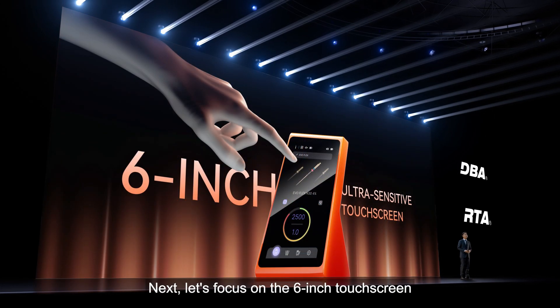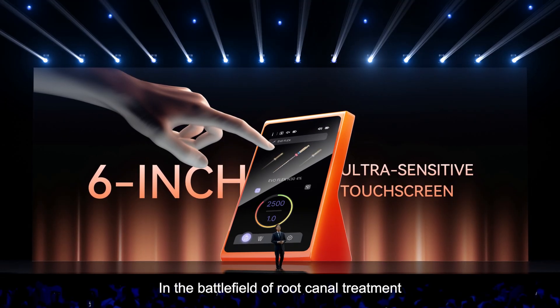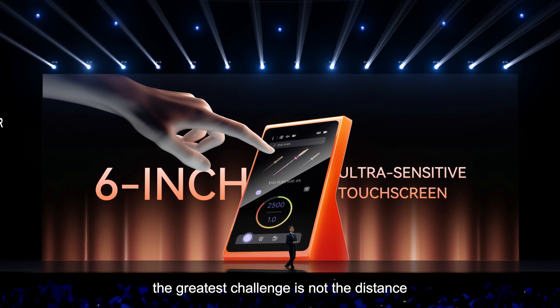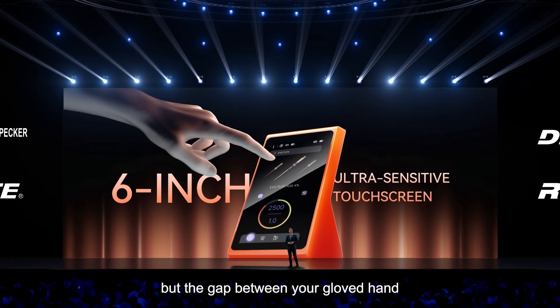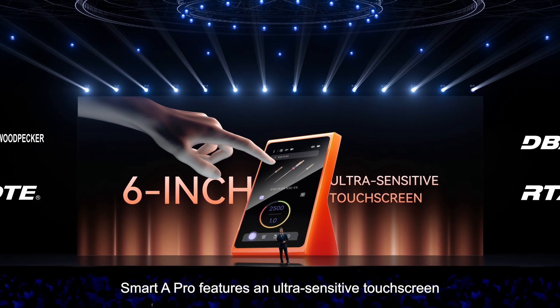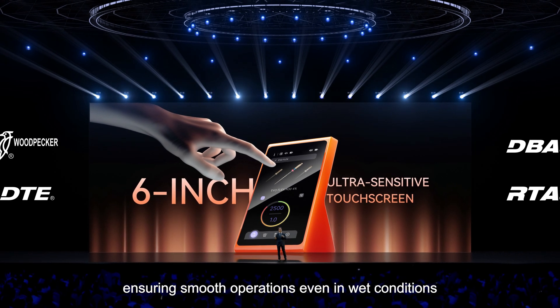Next, let's focus on the 6-inch touchscreen. In the battlefield of root canal treatment, the greatest challenge is not the distance from the apical foramen to the canal orifice, but the gap between your gloved hand and the touchscreen. Smart 8 Pro features an ultra-sensitive touchscreen, ensuring smooth operation even in wet conditions.